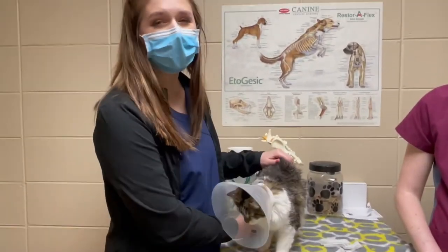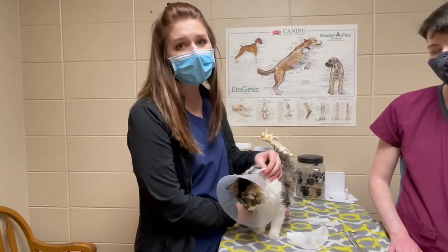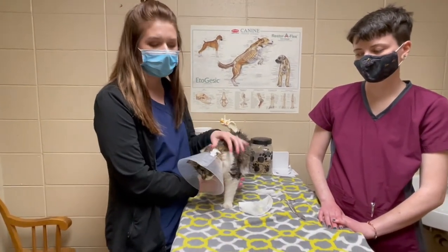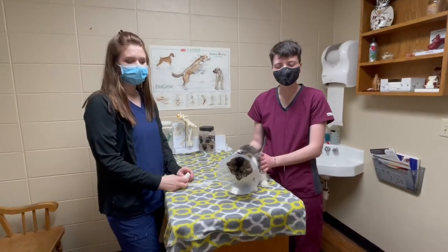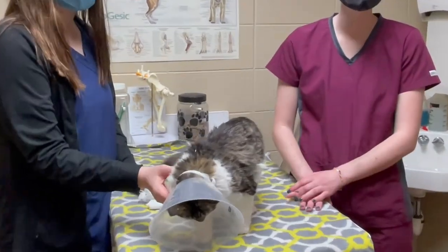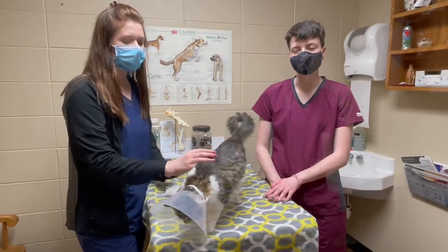Sometimes after they wear the cone for a long time, this gauze piece can either wear out and fall off or get gross. So you can always put their regular collar through these loops and make sure it's secured tightly so they can't get that cone off anymore. You want to make sure you keep the cone on at all times. If they can't eat with their cone on, you can take it off for meals, but make sure you put it back on afterwards and keep an eye on them while it's off.